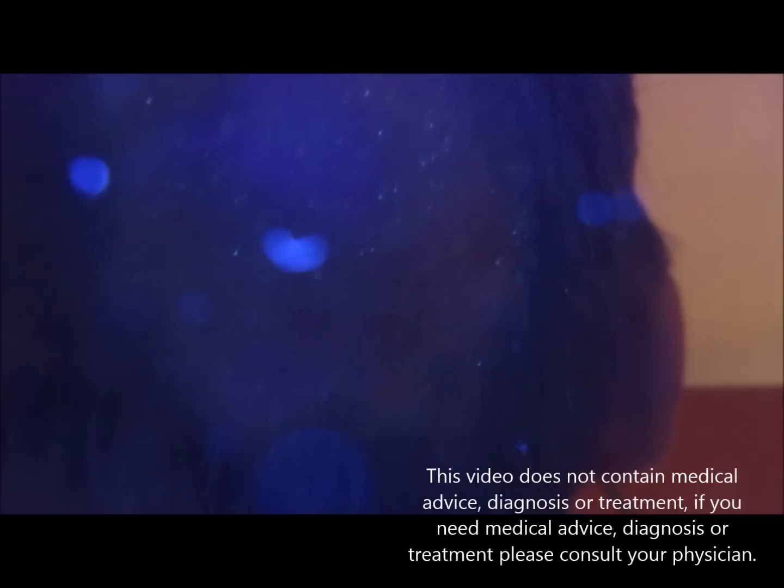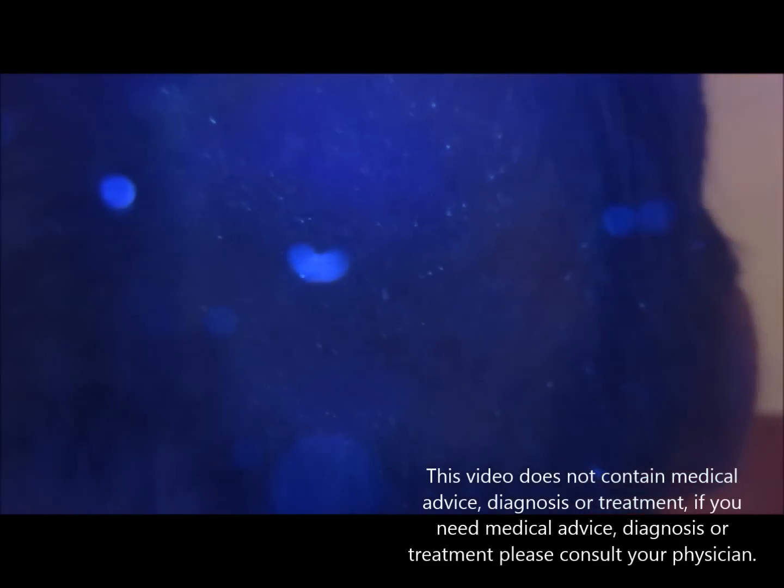Actually it was green in color. Green color is shown by Microsporum species, as well as sometimes Pseudomonas — they also appear greenish.